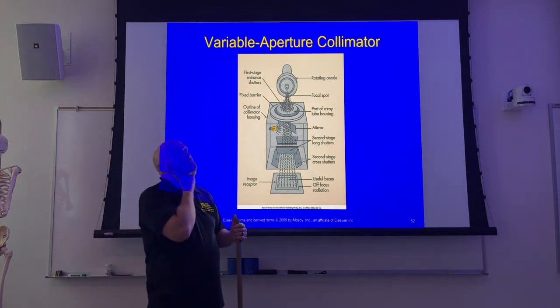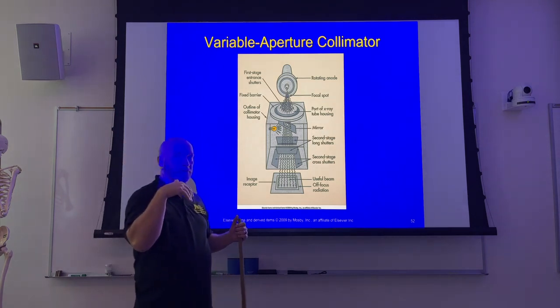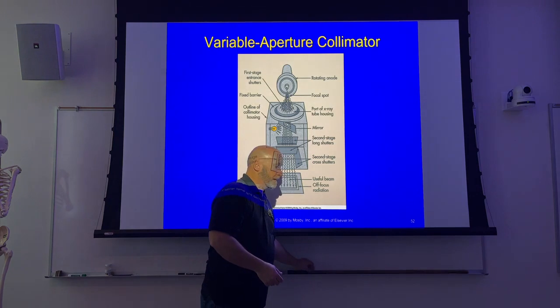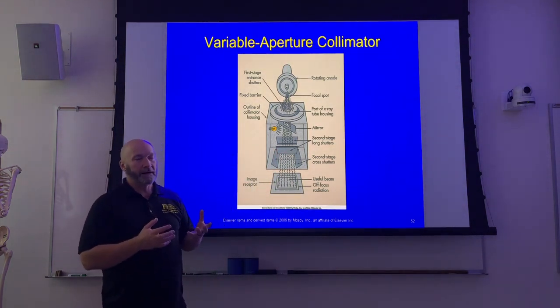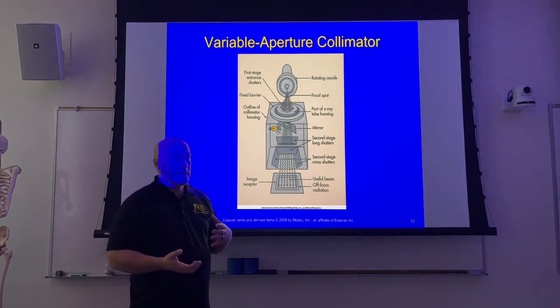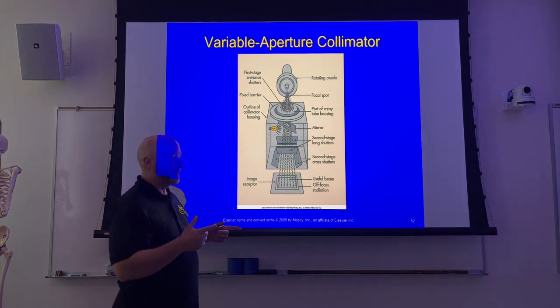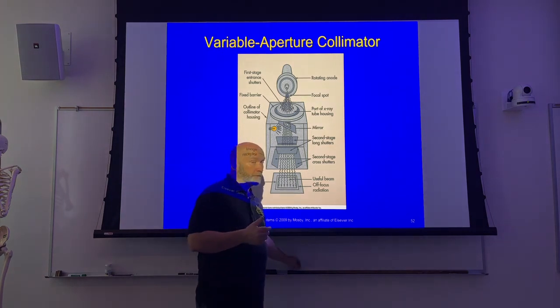All right, so you've got electrons that you accelerate from cathode to anode. And imagine them as being like individual pieces of matter. And if you throw matter at something hard enough, there's the potential it could bounce. It's like a ball. So some of the electrons, as they travel from the cathode to the anode, are going to be traveling really, really fast.